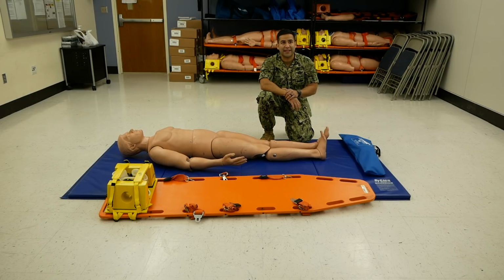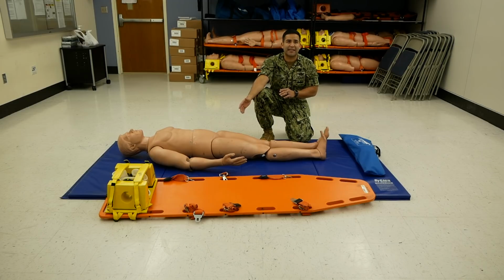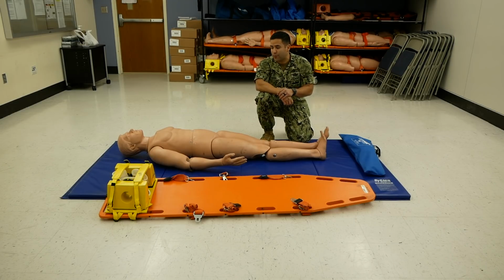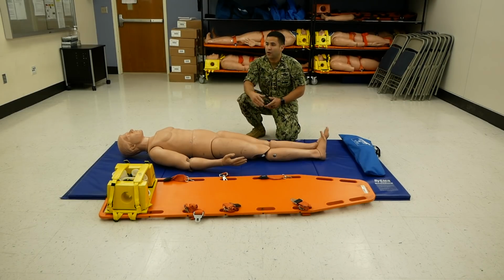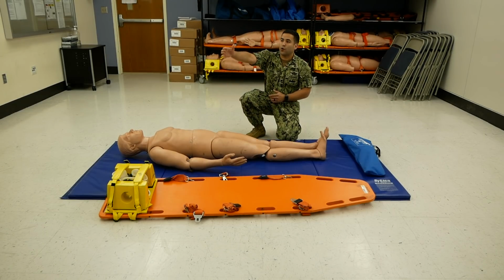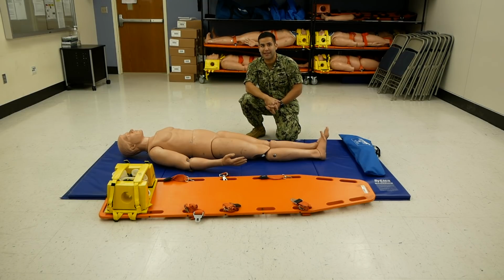The scenario for this will be a motor vehicle accident, or something that indicates a C-spine injury. You will then determine the MOI. For this one, like I said, it's a motor vehicle accident. Determine the number of patients. Right now we have one patient, and then request additional assistance on standby. The additional assistance I have will be HM2 Malter and HM2 Roberson. At this point, I will now ask my assistant, HM2 Roberson, to apply C-spine stabilization.